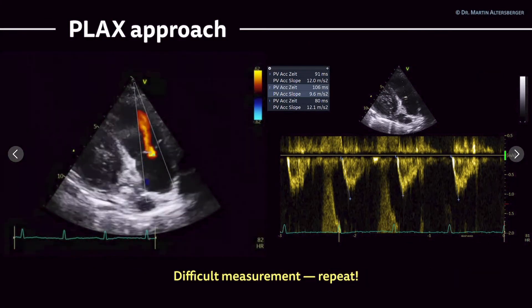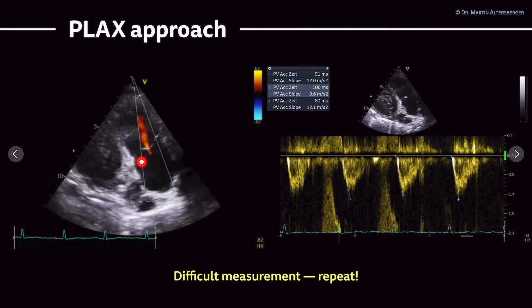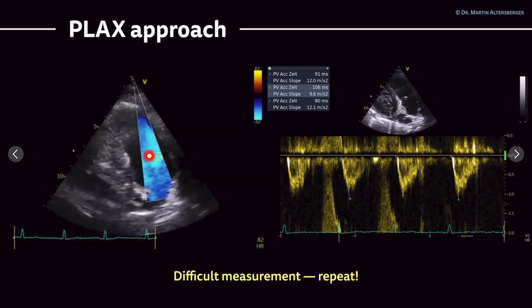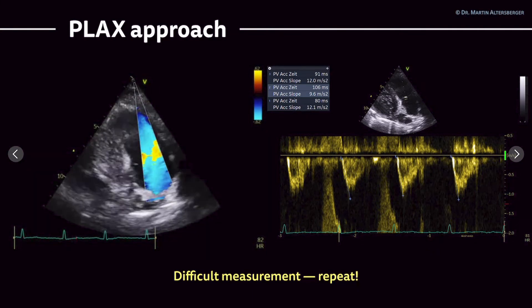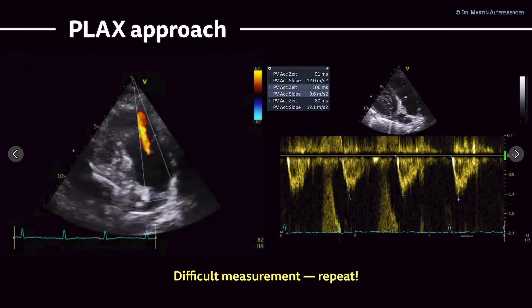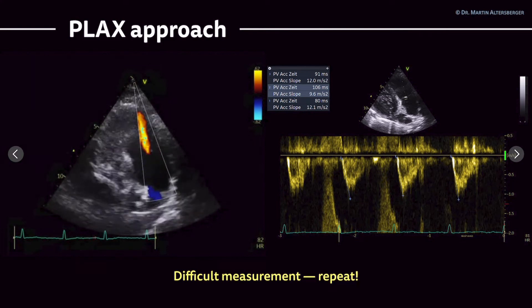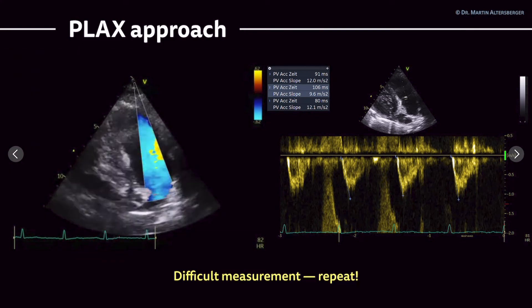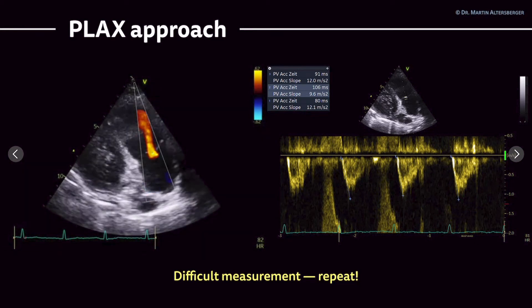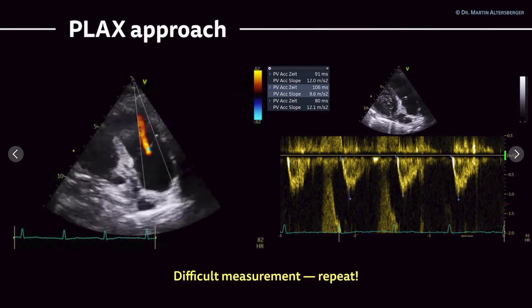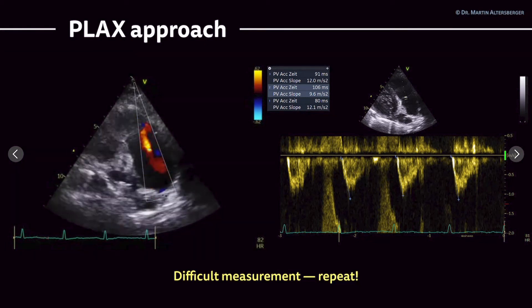You can do the same in a parasternal long axis approach. This is an atypical view of the parasternal long axis, where we have a certain degree of pulmonary regurgitation — I would say mild to moderate. You can measure the pulmonary acceleration time here as well, and you see three measurements, all three a little bit different. Overall, the pulmonary acceleration time in this case is definitely severely reduced.